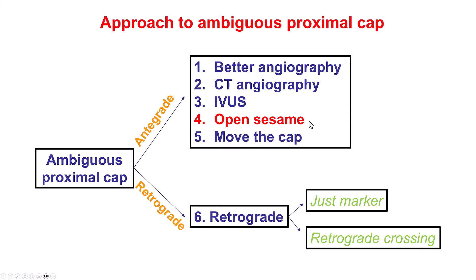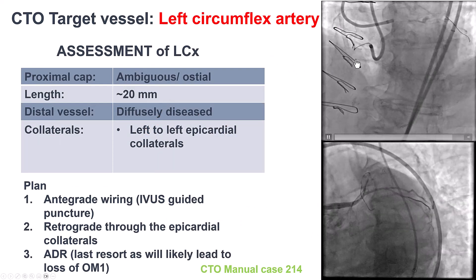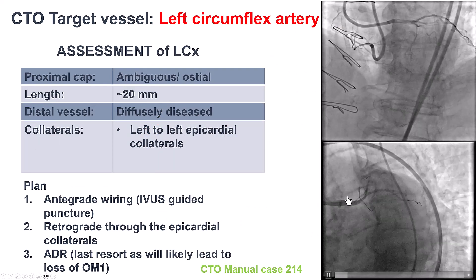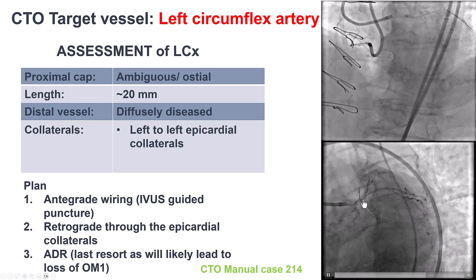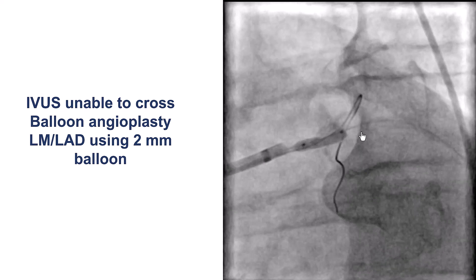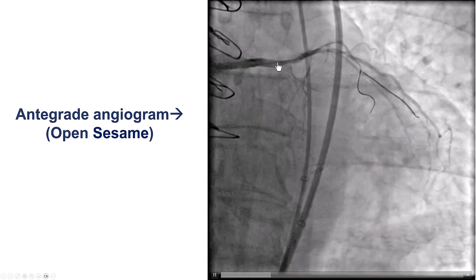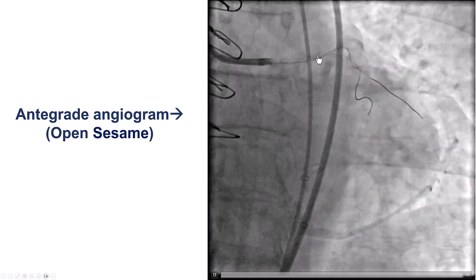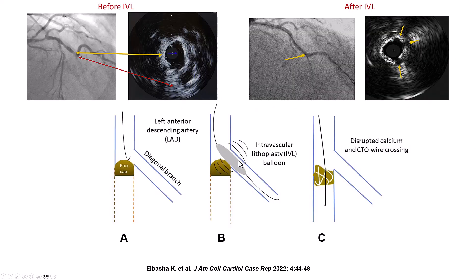The fourth technique is called the open sesame technique. This is an easy technique that also requires a side branch close to the proximal cap. Here we have a circumflex CTO — it's an ostial circumflex CTO — and it's hard to know exactly where the CTO originates. So what we did is take a balloon and inflate it between the left main and the LAD, and after doing that, there was actually some flow going into the circumflex. Open sesame is inflating a balloon between the proximal vessel and the side branch, which helps potentially open a channel along the course of the CTO vessel. This can also be done for heavily calcified lesions using intravascular lithotripsy.